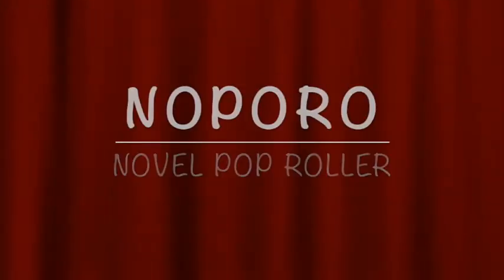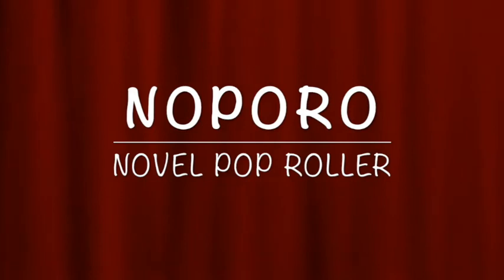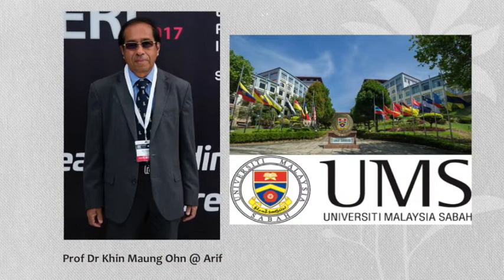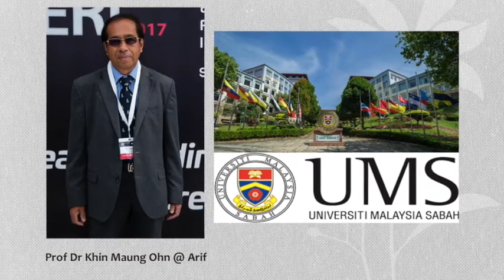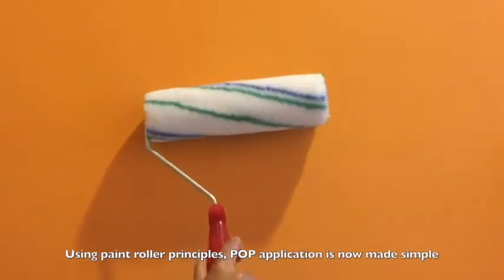Thus, introducing NOPORO, short for Novel POP Roller, innovated by a team led by Prof. Dr. Arif, orthopedic surgeon from University Malaysia Sabah. Using paint roller principles, POP application is now made simple.